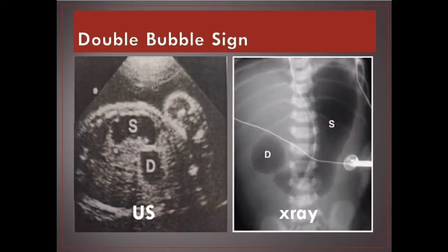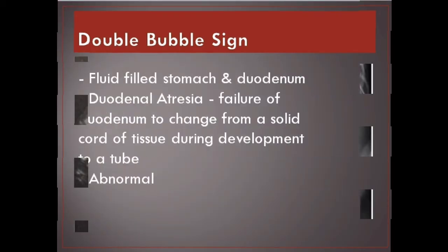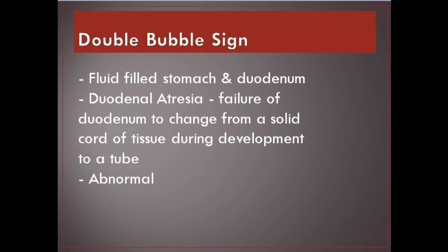Double bubble sign. Fluid-filled stomach and duodenum — duodenal atresia. Failure of the duodenum to change from a solid cord of tissue during development to a tube. Abnormal.